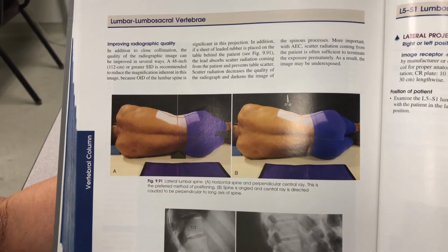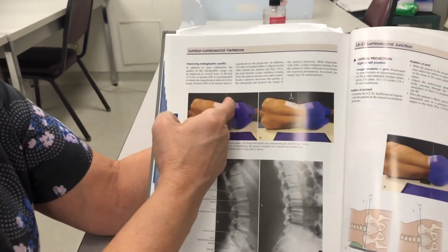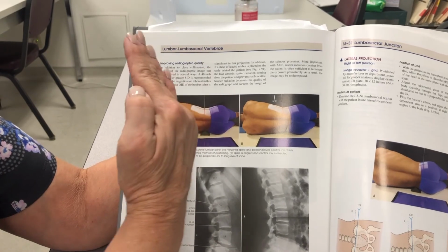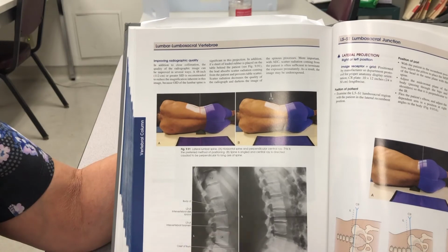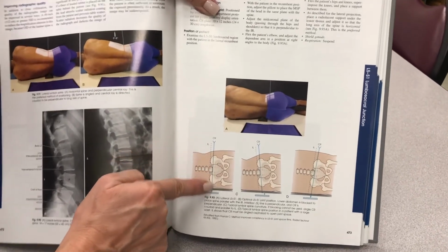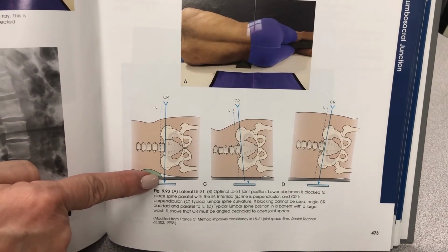So based on your patient's body habitus, what you want to make sure is that the interiliac line between the top of one iliac crest to the other is perpendicular. If it's not, if it's tilted a little bit, then you need to angle to match that interiliac line. Okay, for the L5-S1 spot, again, we're looking at this interiliac line, and if you feel like it is perpendicular to the tabletop, no angulation is necessary.